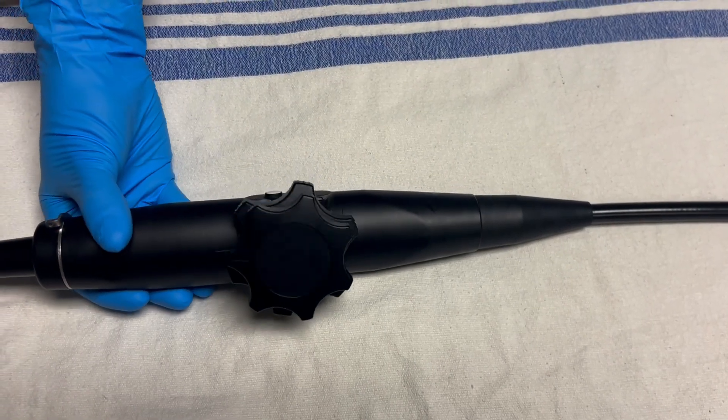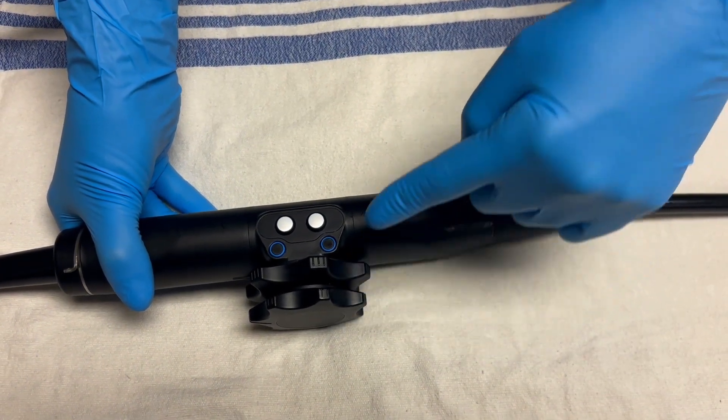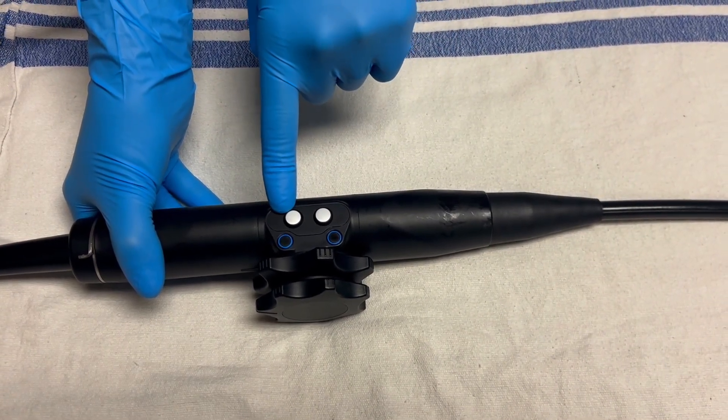Here is the control handle, which you will hold and manipulate as you perform the echo. There is an outer wheel, an inner wheel, as well as two buttons. Many probes also have a locking mechanism for the wheel.